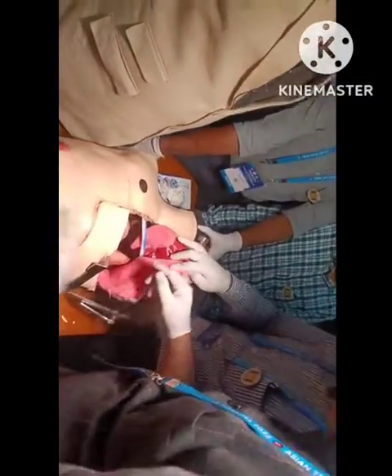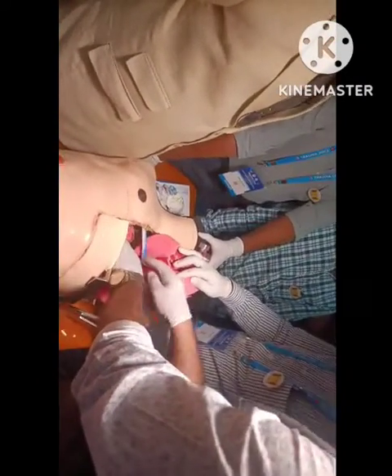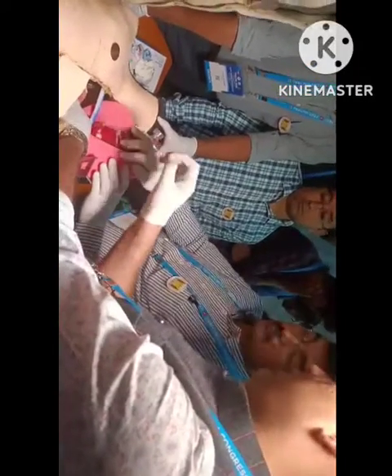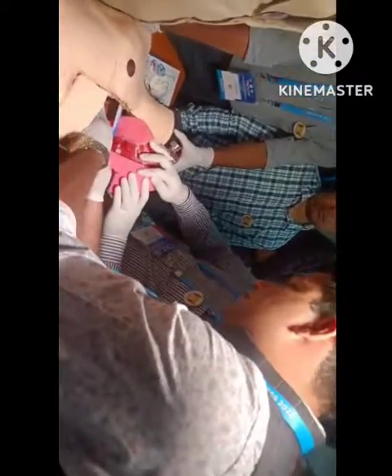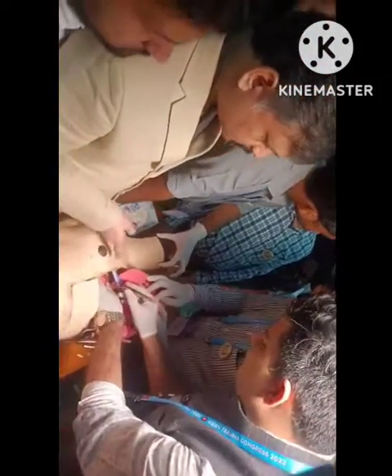What next? Next, I will put my finger at the. So this is a very important step. First, you have to release the heart from the pericardium. Extract the heart from the pericardium and look for the injury site. I am seeing here that. So ideally, after the pericardium, we should have exposed the heart. Now yes, I will put my finger and.